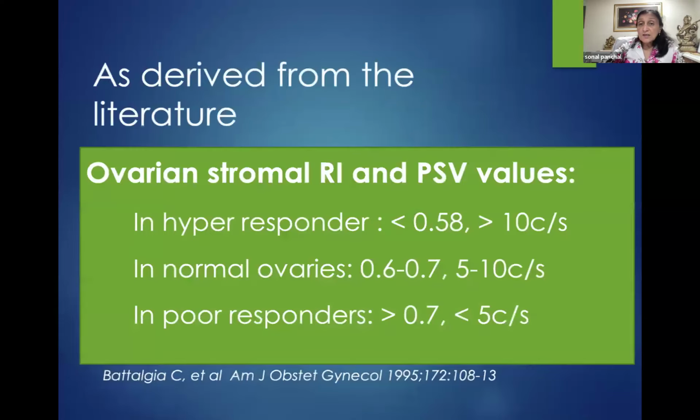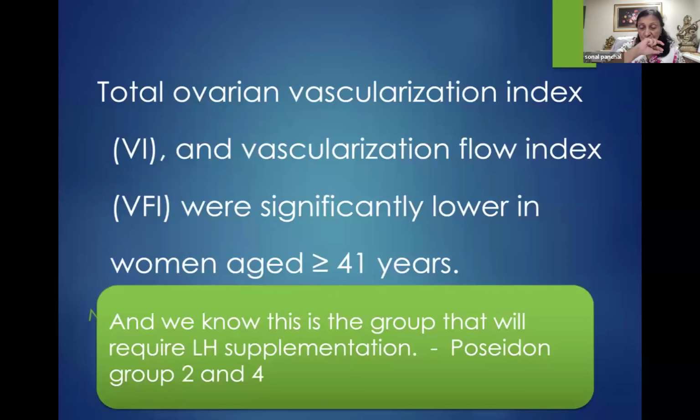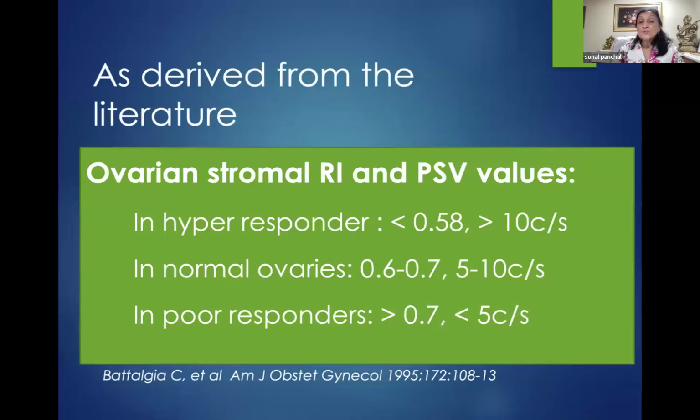Very interestingly, if I say that the patient's ovarian stromal vascularity correlates with the ovarian response, there are definite parameters on the 2D Doppler also, which tell us about the response of the ovaries to the ovulation induction or to the ovarian stimulation.